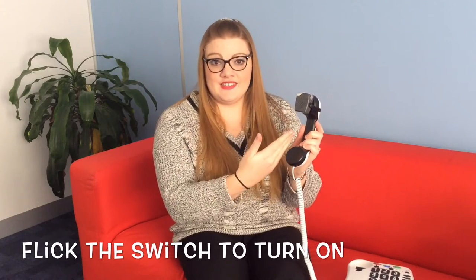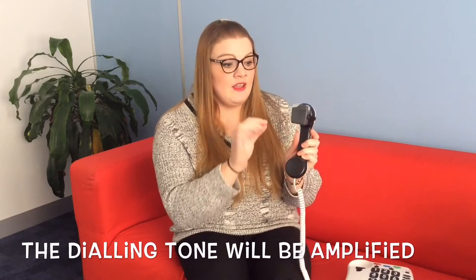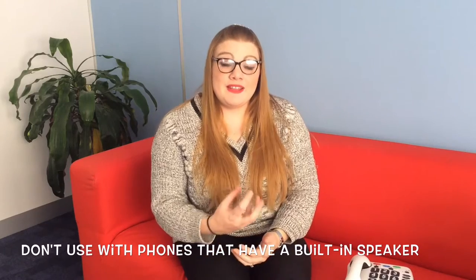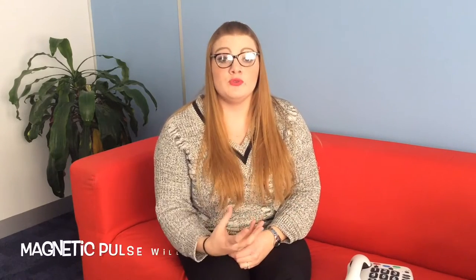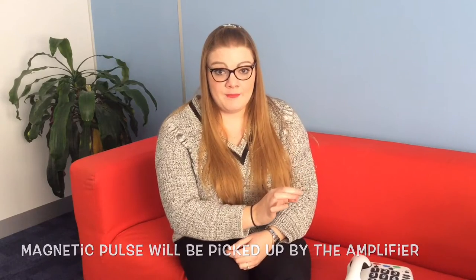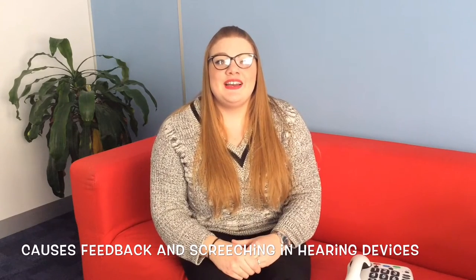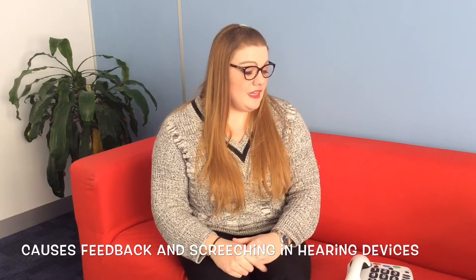To turn the device on, just flick the switch. You won't be able to hear it from where you are, but sitting next to the telephone I can clearly hear the dialing tone has been amplified. One important thing to note: the telephone amplifier doesn't work well on phones with a built-in speaker, because the speaker emits a magnetic pulse that gets picked up by the amplifier, making it much louder and causing feedback and a screeching noise in your hearing aid — which will not be pleasant. So bear that in mind when using the telephone amplifier.